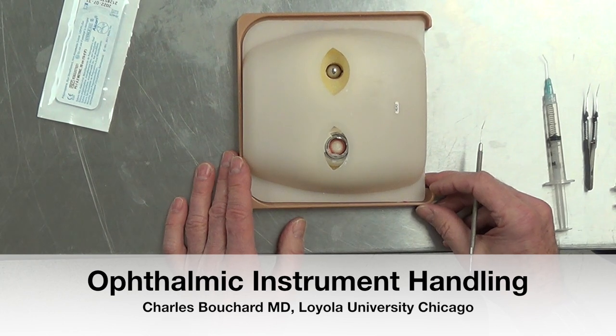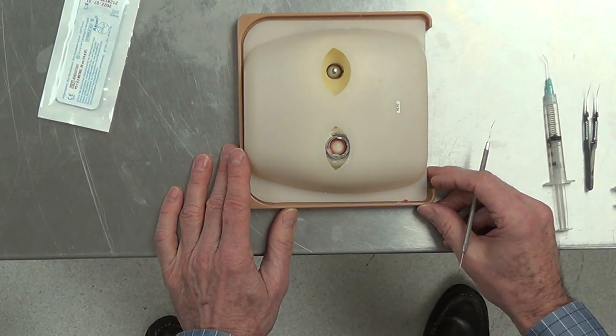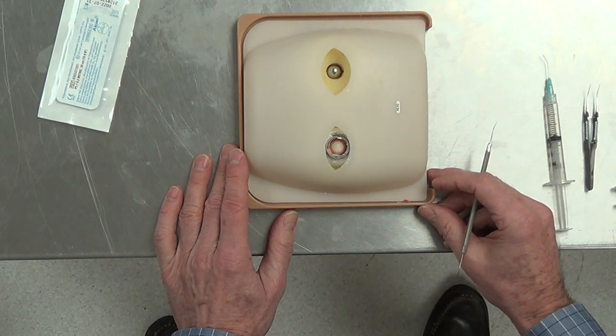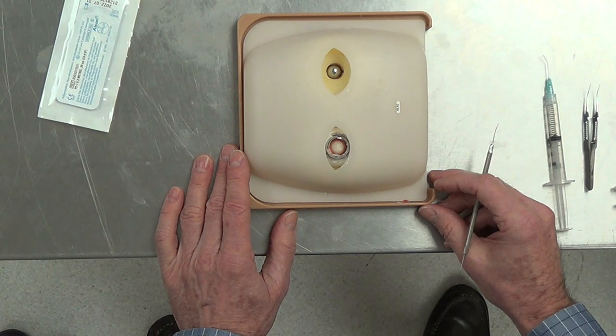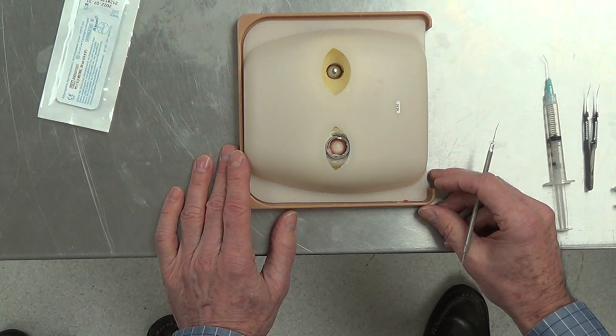There are four major principles of ophthalmic surgery. One is that when you operate on the eye, you don't want to move the eye. The second is that when you insert and remove instruments, you want to minimally distort the wound. Because if you do, the viscoelastic comes out, the chamber collapses and you're not stable.